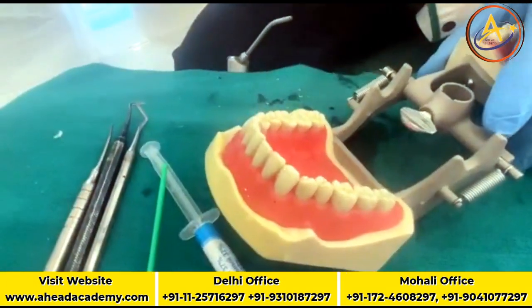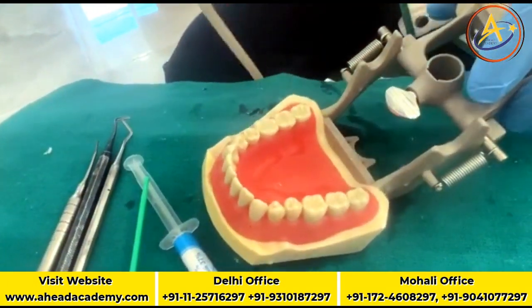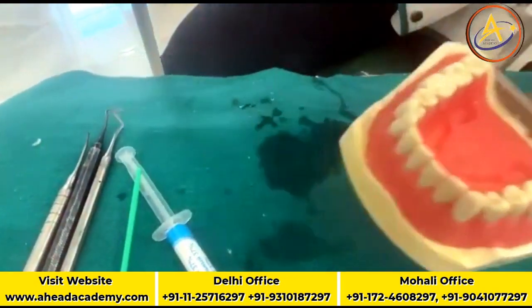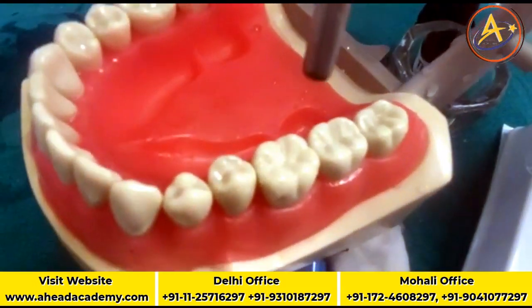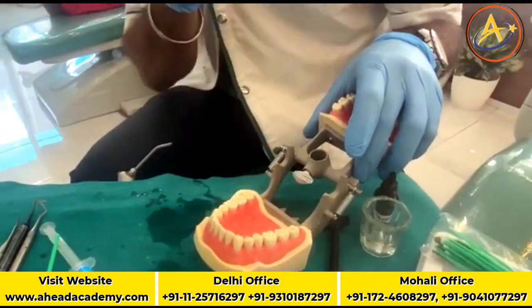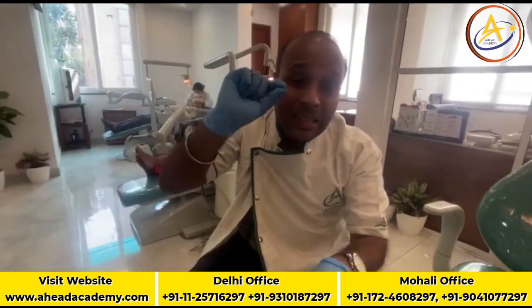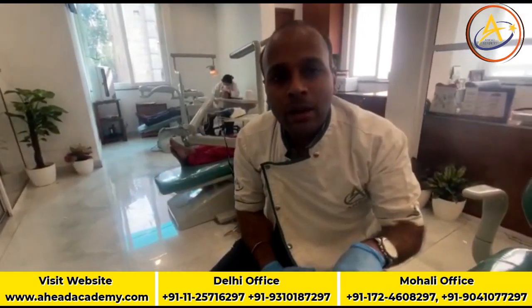Then after 1 minute, you have to remove the excess bonding agent. How to remove excess bonding agent? With a three-way air syringe. Just see, when I am doing this, you will be able to see the bonding agent flow. This is displacing the extra bonding agent. Remember, the bonding will be good when the bonding agent is in a thin layer. Whenever the bonding agent is in a thick layer, bonding will be very, very poor.